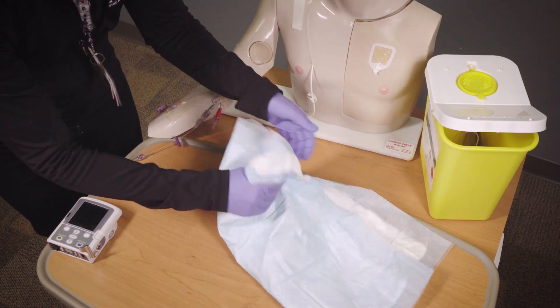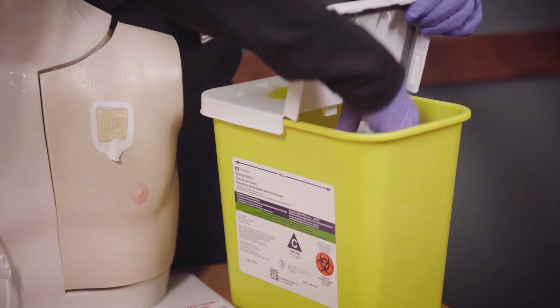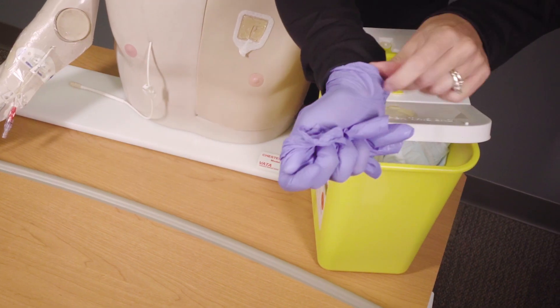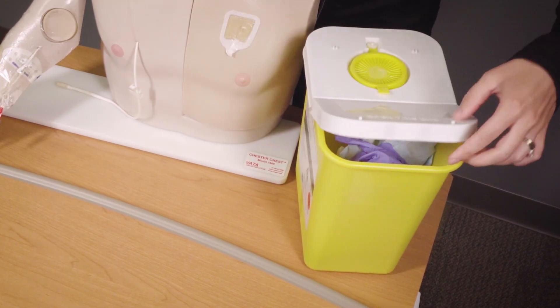Bundle up all the items in your work area and put them in the chemotainer, followed by your gloves. Be sure not to snap the lid down onto the chemotainer as this will lock the chemotainer and you will not be able to use it again. Snap the lid down only when it's full.